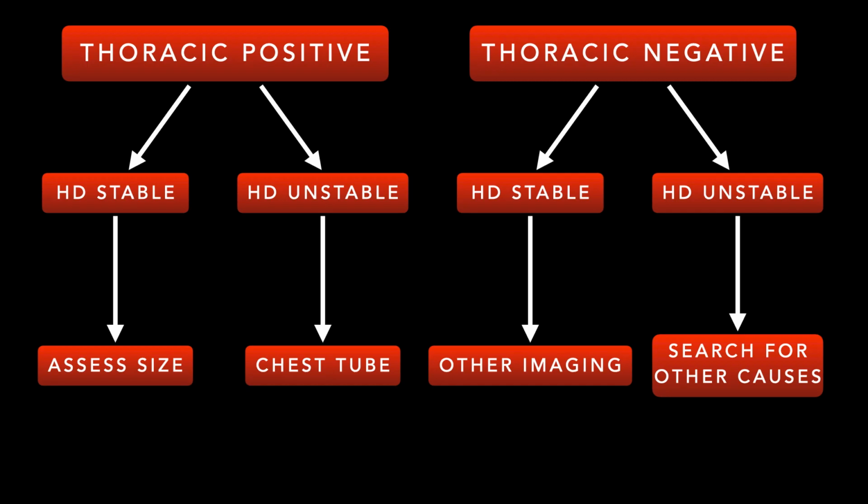You can kind of take a breather, maybe slow it down. You don't have to rush this thing in there. Get your nice sterile prep, just do it, get it done right. If it's not big, if it's super duper small, then this may be one that you just want to note and then just observe and make sure that there's no further hemodynamic changes with this patient, right?